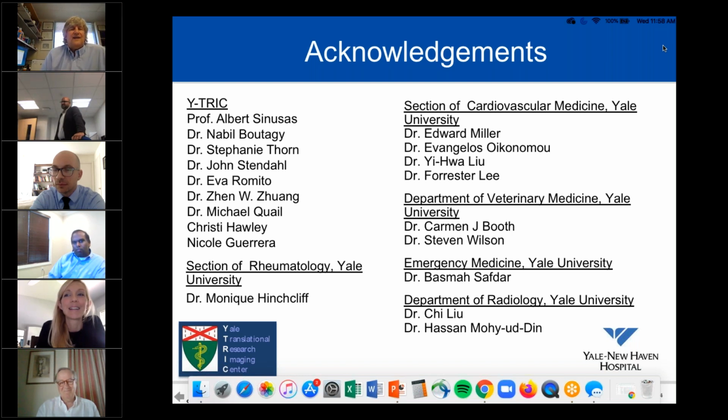So just to comment and follow up. I think it is important, as Venk alluded to, that you correct for the resting rate pressure product. I think we also find it important to correct for the stress rate pressure product because the catecholamine state and other factors will affect maximum achievable flow for a given patient. And so I think that helps with the reproducibility. But again, there is variability in this measurement.